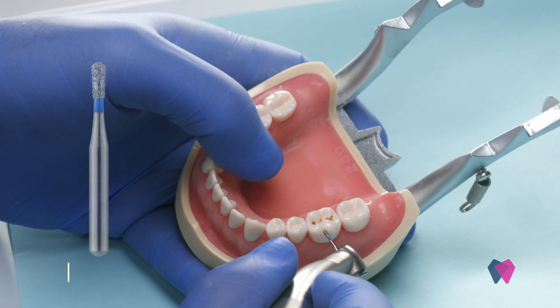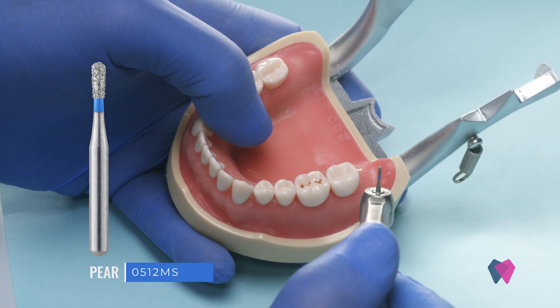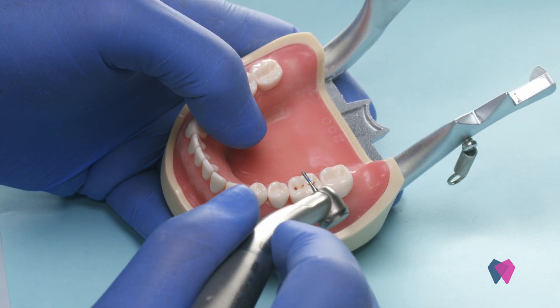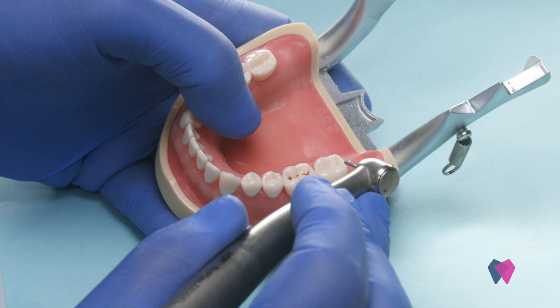When it comes to working in the posterior part of the mouth, I like the short shank burrs for my occlusal preparations or anywhere that I'm trying to do a crown preparation. It just gives me a little bit more space, even when I've got a very small head on my handpiece.